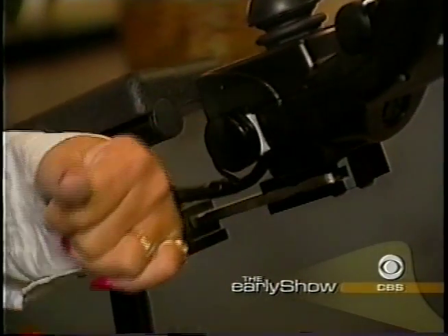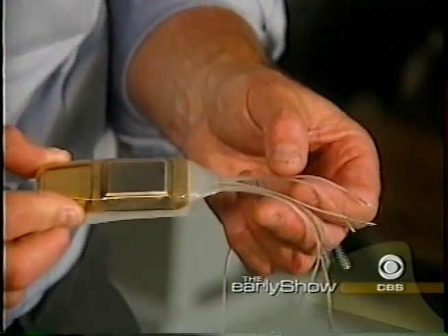But today, she can, thanks to an amazing system called FES. FES is functional electrical stimulation, and functional electrical stimulation is using low levels of electricity in order to activate nerves and muscles in order to restore movement. With the touch of a button, Annette turns on a device, much like a pacemaker, that's implanted in her chest. This is a multi-channel implantable device.